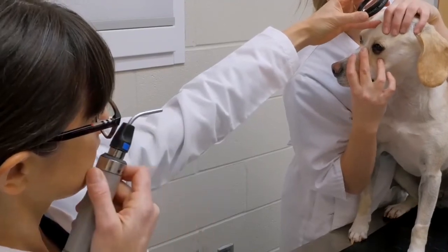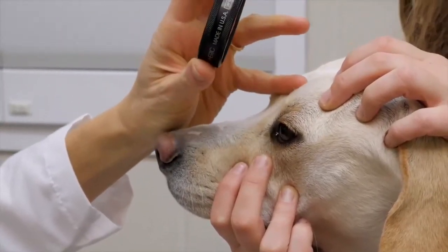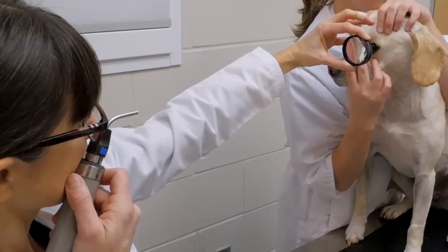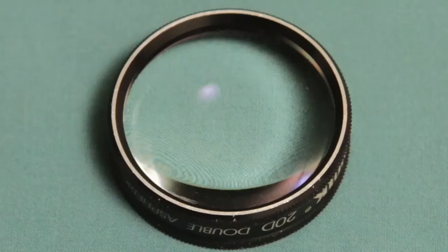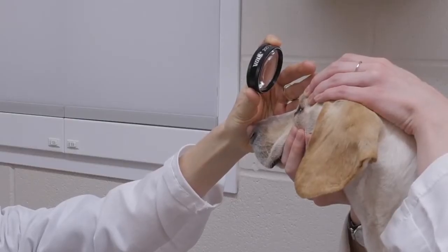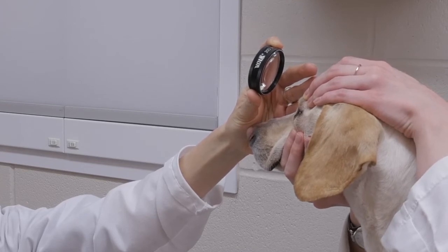To begin indirect ophthalmoscopy, the lens is held with the thumb and forefinger about 6 to 8 centimeters from the animal's eye, and the remaining fingers are placed on the animal's forehead to stabilize the lens and help retract the upper eyelid. Most lenses have a white ring on one side which identifies the side of the lens that should face the animal. The lens should initially just be held on the head and not in front of the cornea until the examiner is ready.